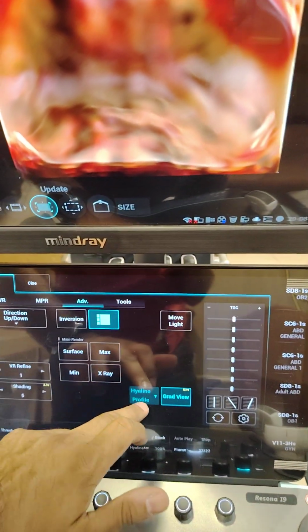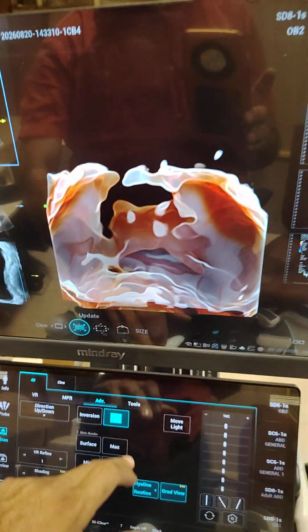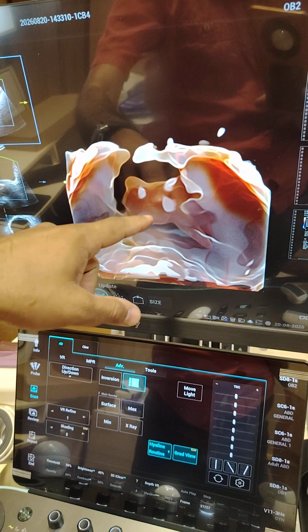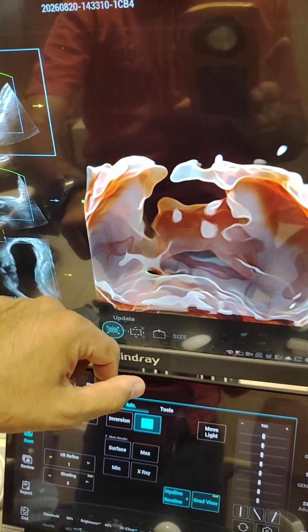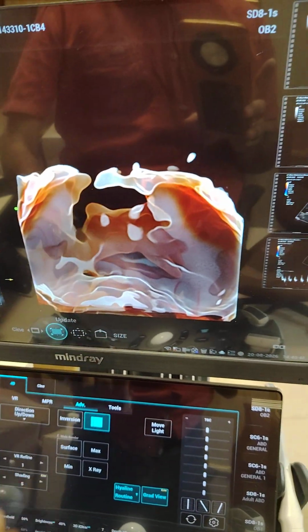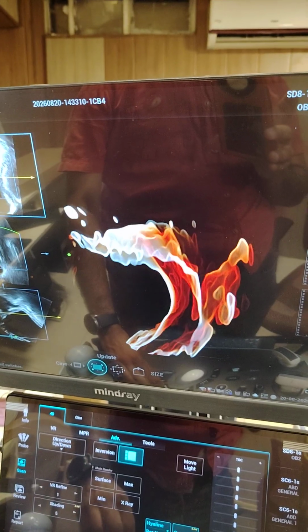And this is the silhouetting mode. You can see, so for example routine, it gives us the internal structures will be available, like so, for example the renal, stomach, or the fetal heart within the silhouetted fetus.